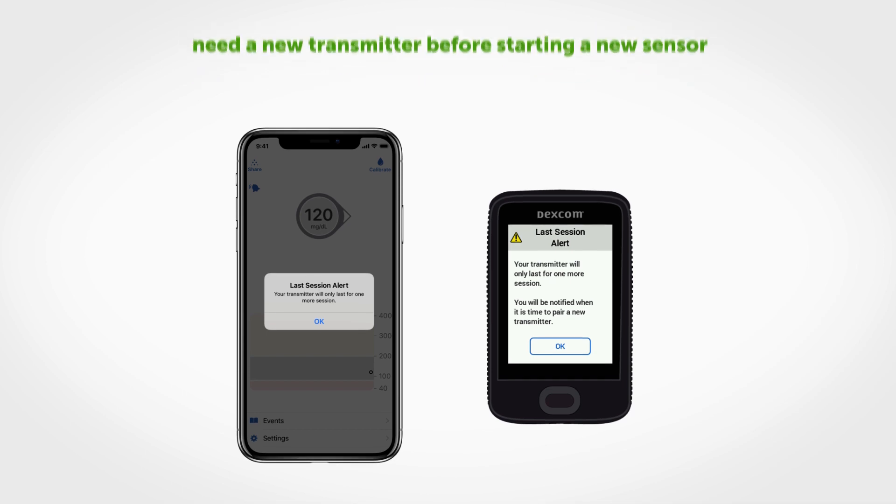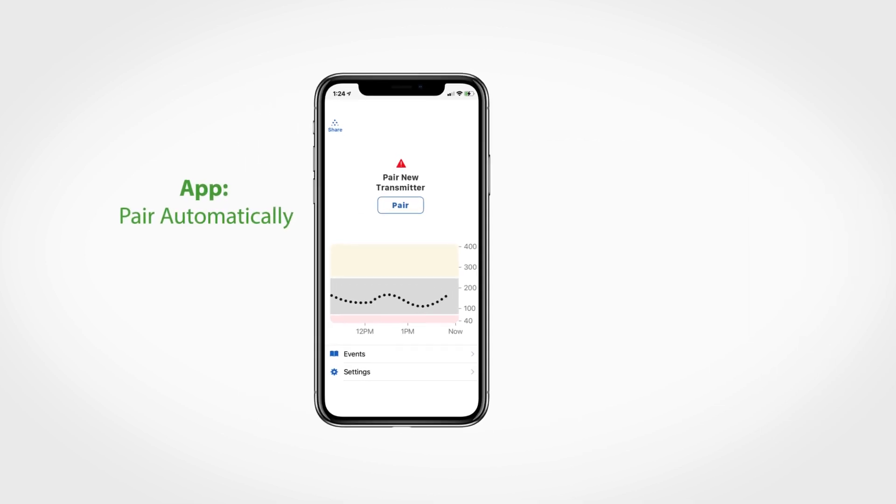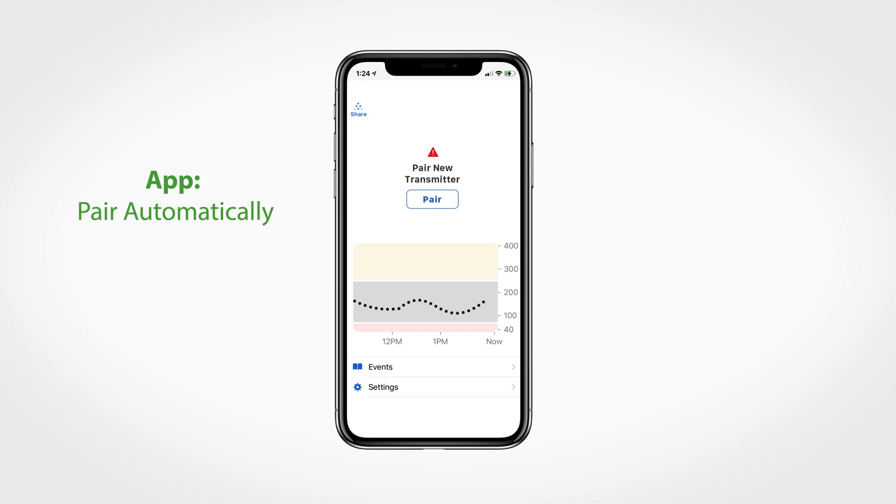There are two ways to pair a new transmitter: automatically or manually. To automatically pair a new transmitter from your phone, wait until you receive the pair new transmitter alert and then press pair.